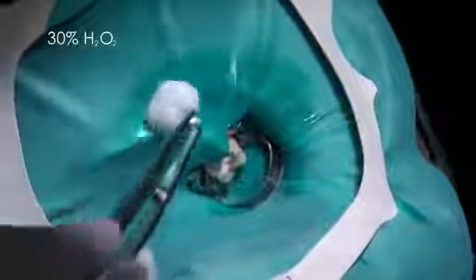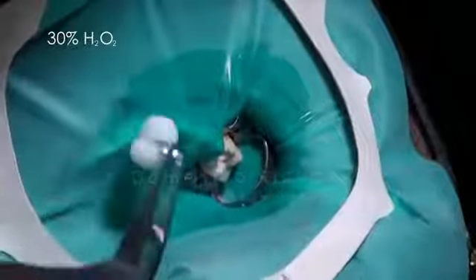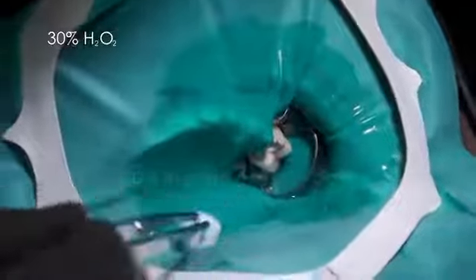Field disinfection followed. The rubber dam, the tooth, and the clamp were disinfected with 30% H2O2 followed by sodium hypochlorite.